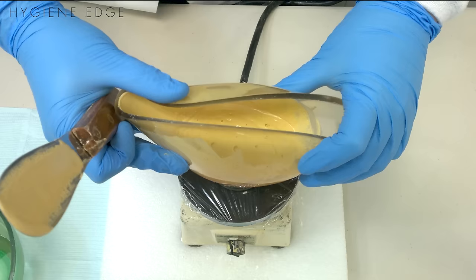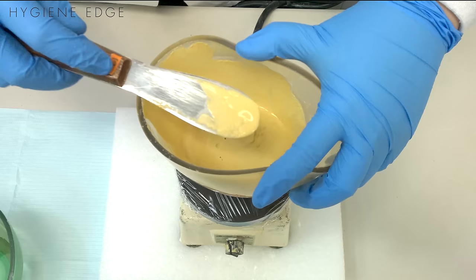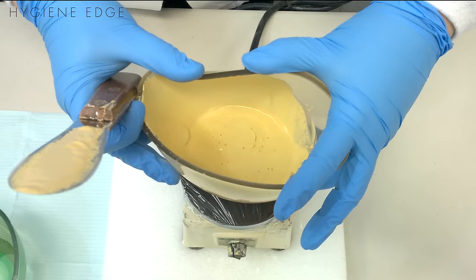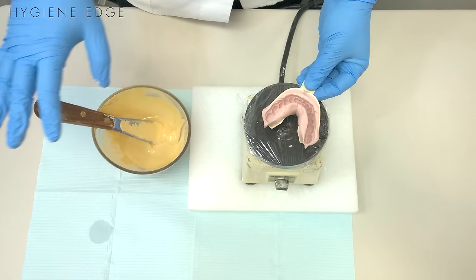A lot of people like to use their spatula and try to pop the bubbles. I wouldn't recommend doing that because that's going to incorporate air into your mixture. Just keep it on there for about 30 seconds until you see all the big bubbles come to the top, and you're done.